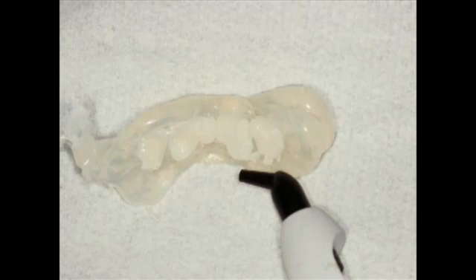I took Herculite in the shade that we wanted, I believe it was A1, and I inject it into the labial surfaces of the maxillary 4 teeth where we're going to make temporary porcelain or composite laminate veneers for this patient. And when you take something like Herculite, you need to condense it into this surface. So I take a smooth surface condenser and I condense it into the surface of the impression so it picks up all the subtle irregularities, enamel irregularities that this patient presented with.